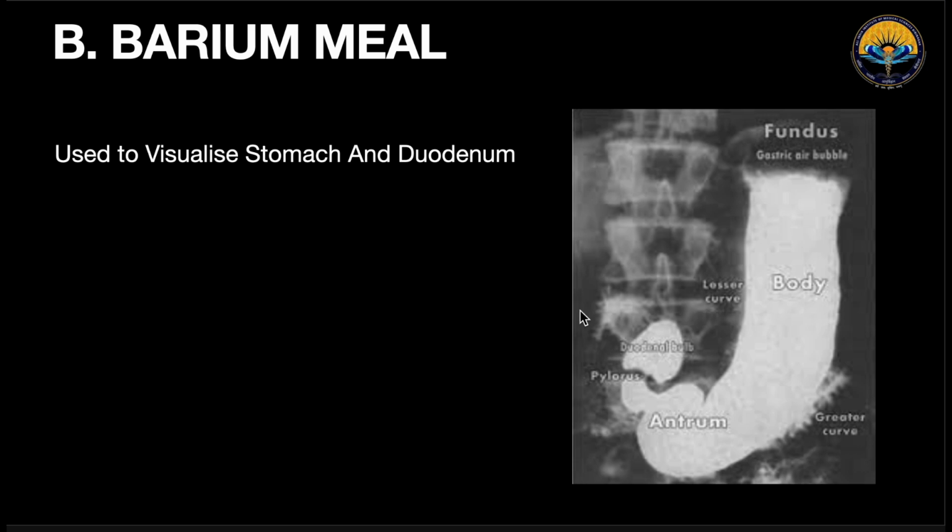Coming to the second, barium meal. So barium meal is used to visualize the stomach and duodenum, and it visualizes till the duodenojejunal junction.